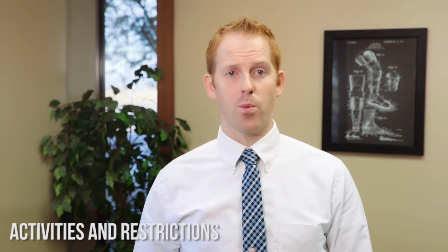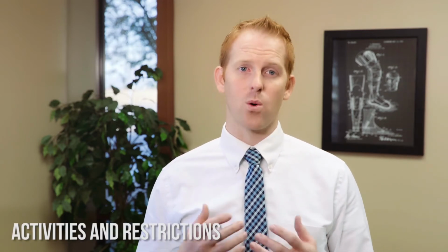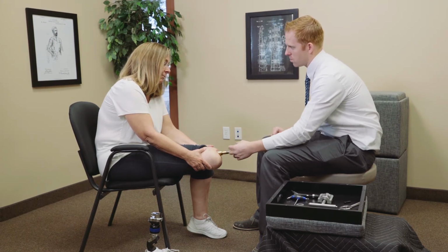The OGAP OPL osseointegration system has the main goal of increasing comfort and quality of lifestyle. This does not mean that it allows the patient to return to all previous activities. There are some guidelines and restrictions that are recommended. Generally, the patient should avoid any situation that would expose the stoma, or opening around the dual cone adapter, to excessive amounts of bacteria. This could lead to dangerous infection.